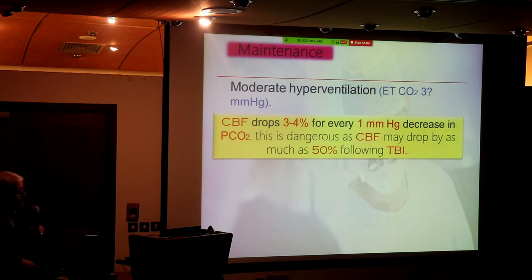Doctor, this was already ruptured, correct? Yes, this patient. Already ruptured, but that doesn't mean we take it easy. We just don't want any further bleeding. Oh, thank you, so it's ruptured already. Okay, no, it's not like that.